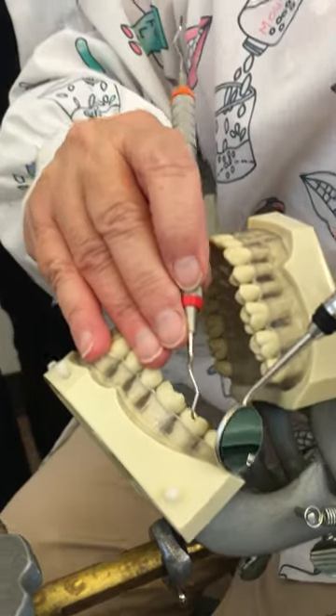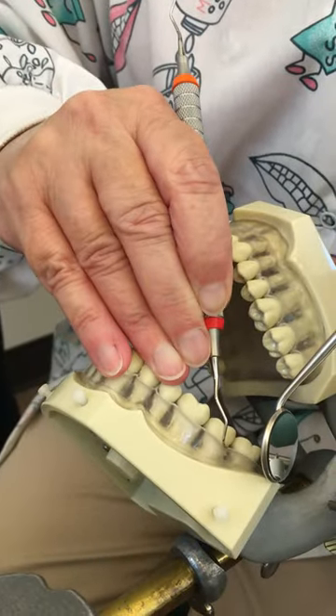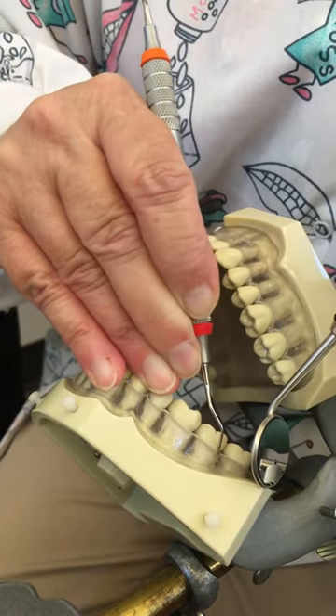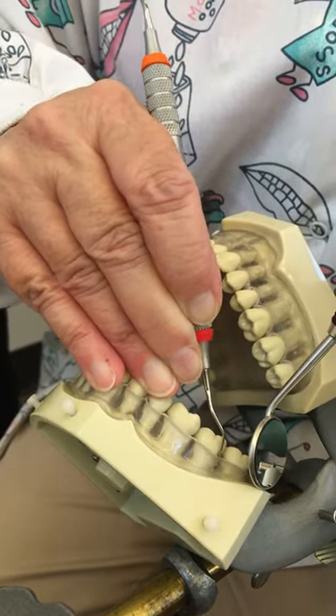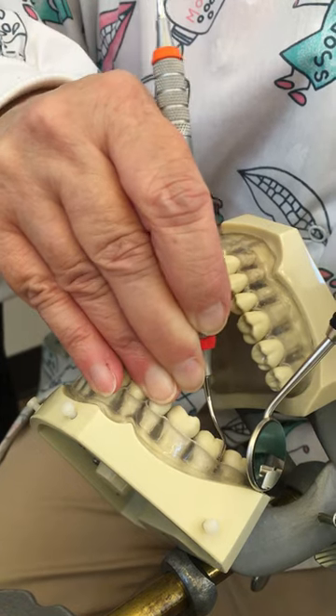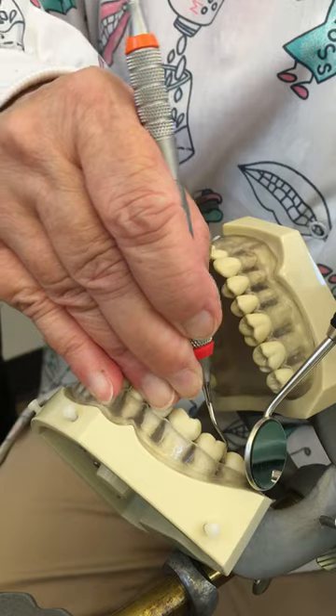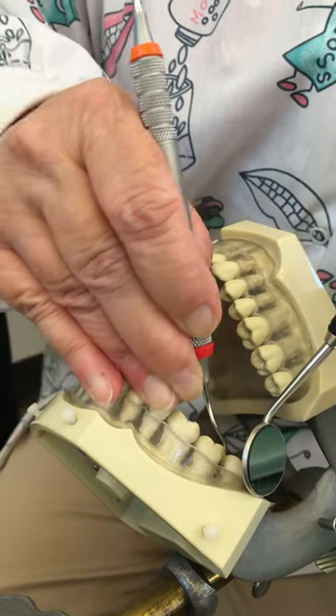I'm going to go to the next tooth, adjust my grasp, go enclosed, and then open beginning at the distal line angle. And I have to pull my handle slightly out so that I can go across that distal surface.